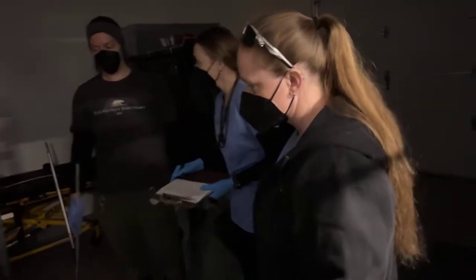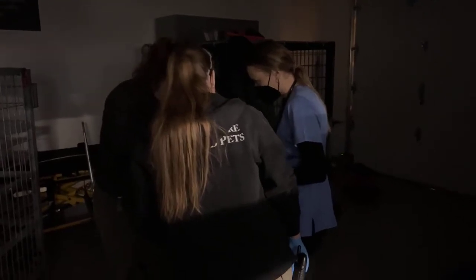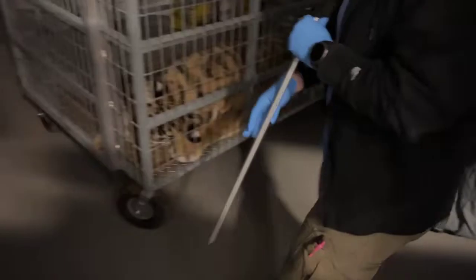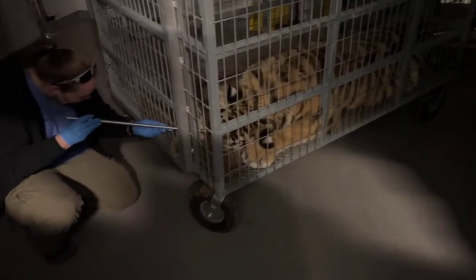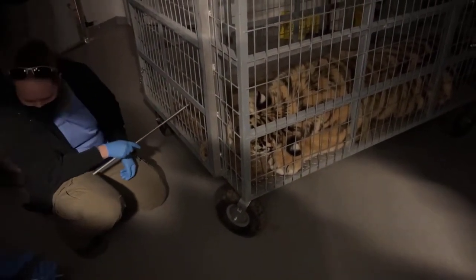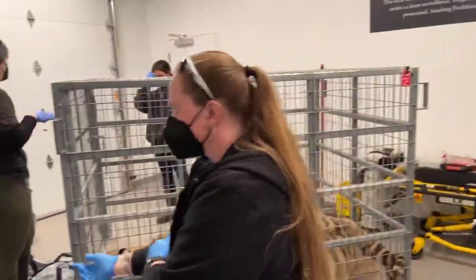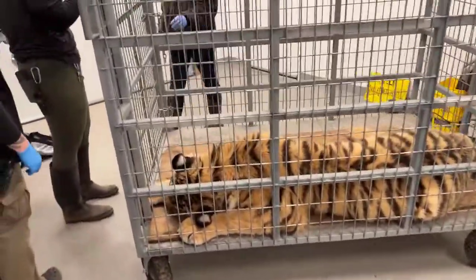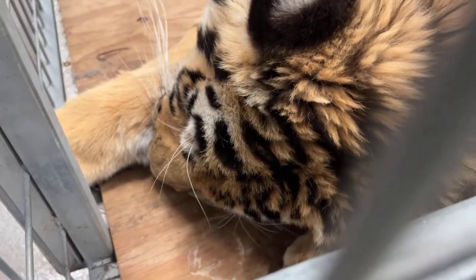And so they're discussing again next steps or how long they're going to wait. And now, as a double check, making some noise is the final check. We can turn on the light to the rescue bay. Whoops, can you turn it on? There you go, that double light. So now you can see we can raise our voices again. He's been checked that he is fully sedated from anesthesia and can be safely moved.